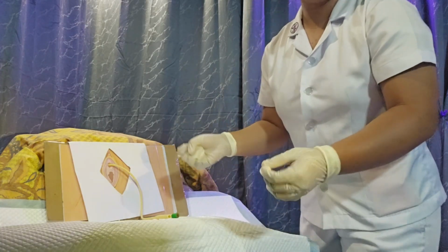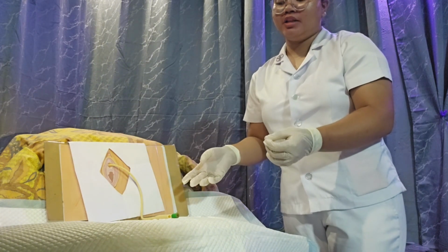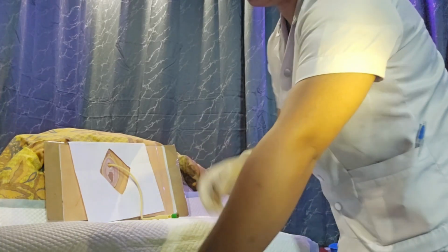So since we inflated the balloon, we are now going to connect the urine bag to the catheter, making sure that the tube does not fall on top of the bag.